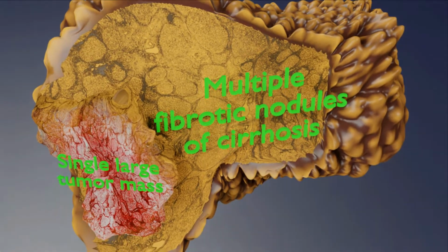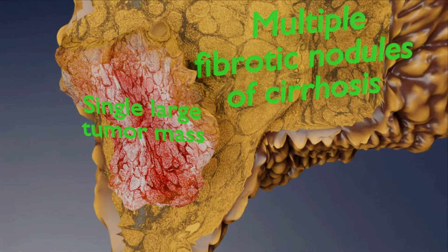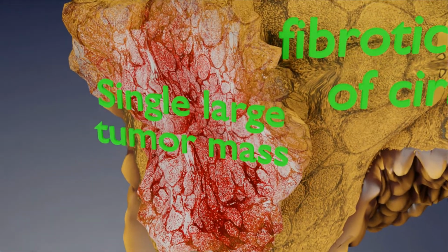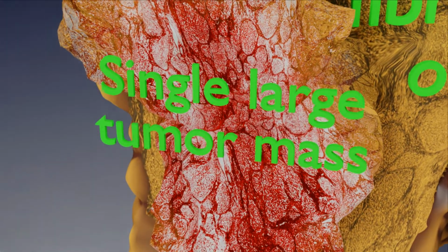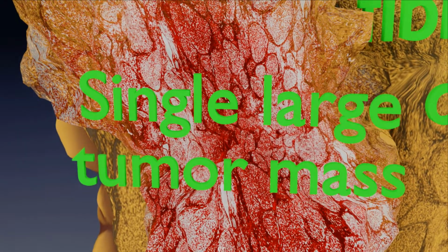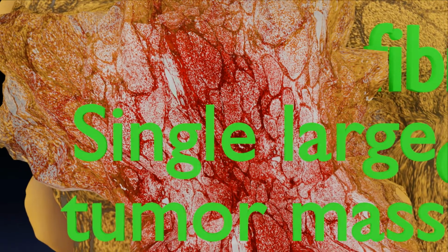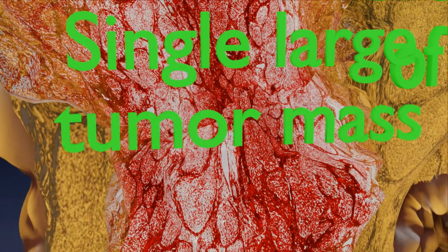Hepatocellular carcinoma is seen here as a large solitary nodule with irregular borders and having a central area of redness. This central red area is an area of hemorrhage and necrosis. Hepatocellular carcinoma should be suspected when a patient with known cirrhosis presents with any new symptom such as pain, loss of weight, fever, increasing liver size or increasing ascites.